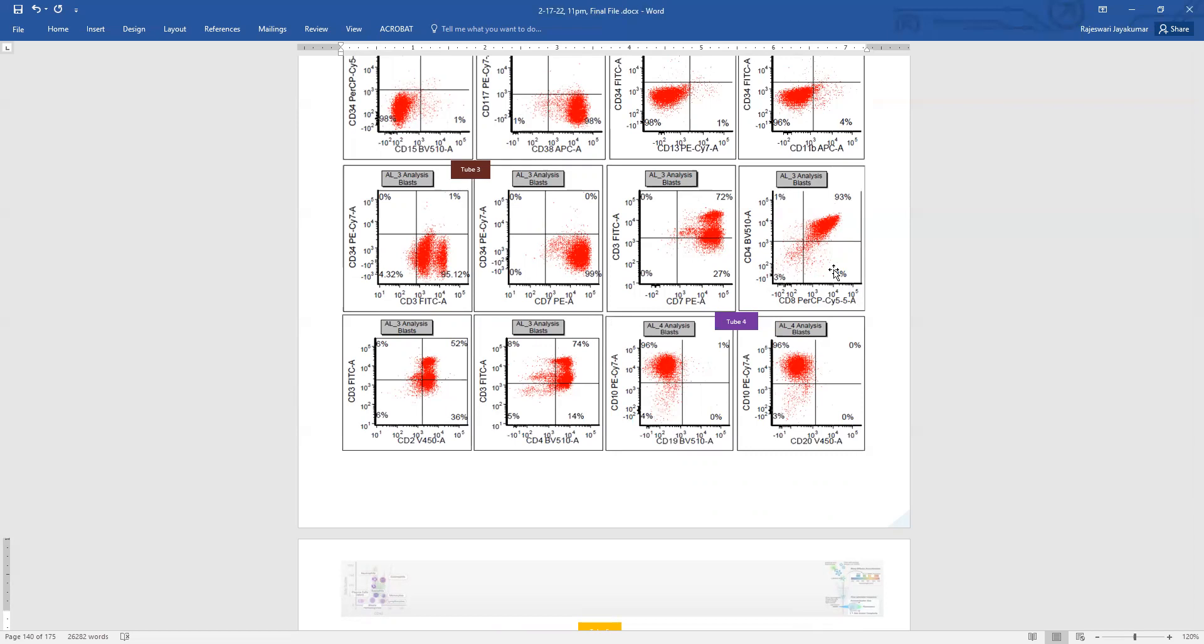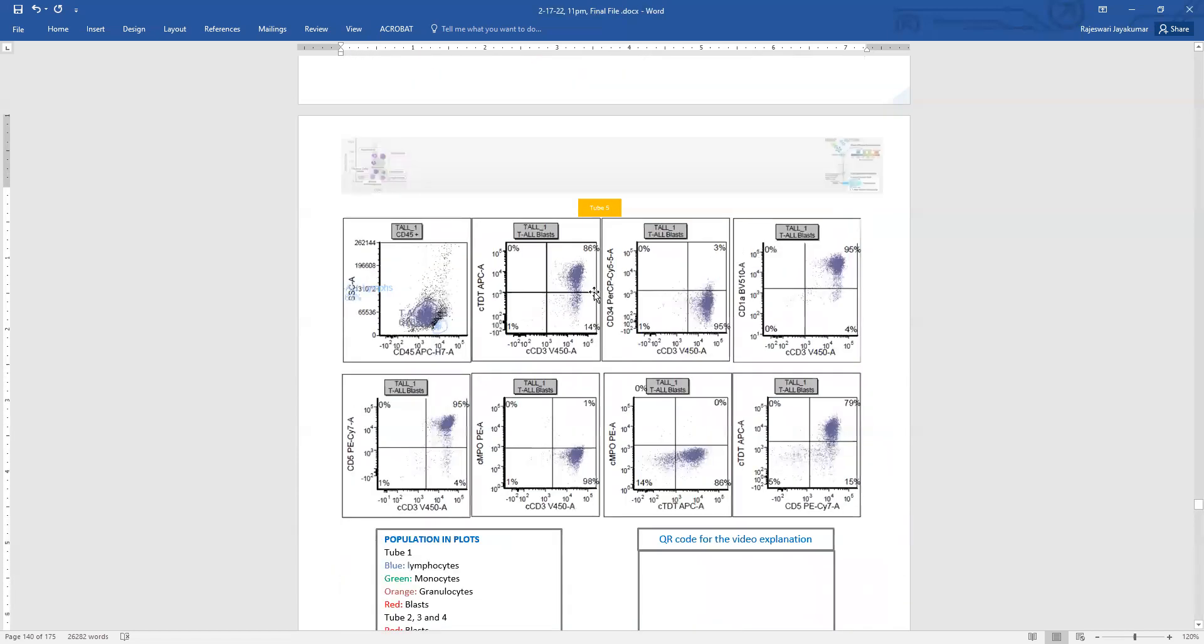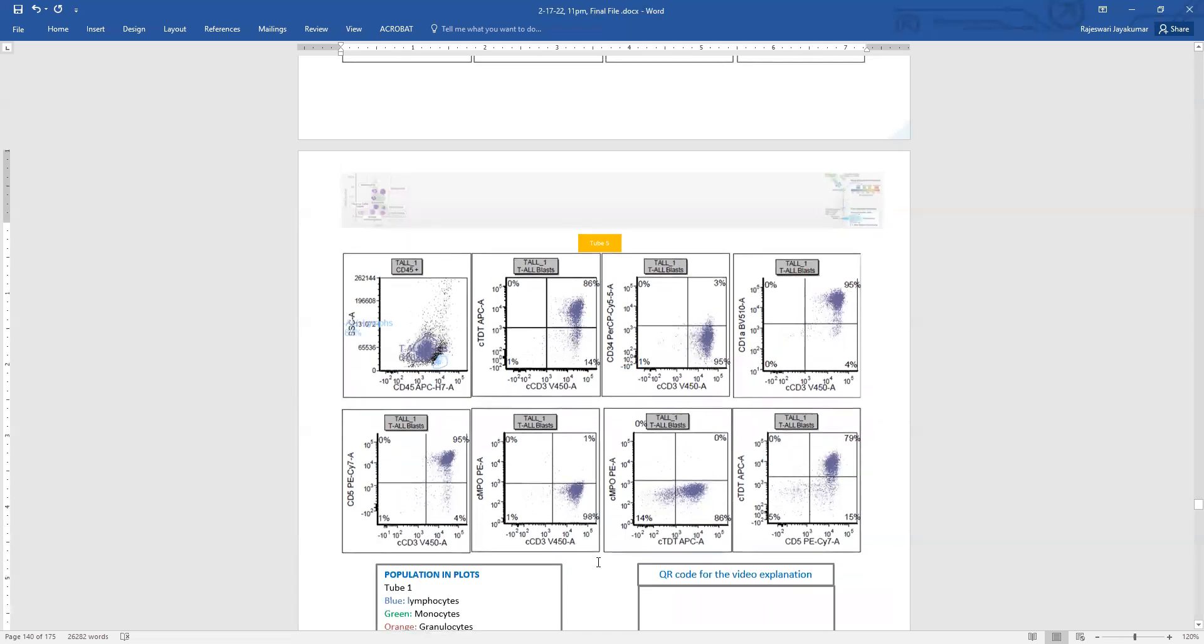So here you don't see a dynamic population. This population is all clustering into one. So they are all just 4 and 8 positive, and they are all immature. So even though in thymus you will see those immature cells with TDT or CD34 showing both 4 and 8 positive, you will also see the population moving towards like a smearing pattern moving towards maturation. Here you don't see that. This is just a tight cluster of immature cells, and all the cells are in this one gate. Therefore, you can call it confidently as T lymphoblastic leukemia lymphoma.